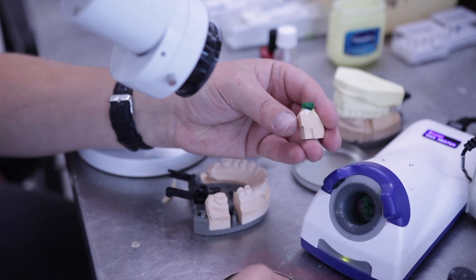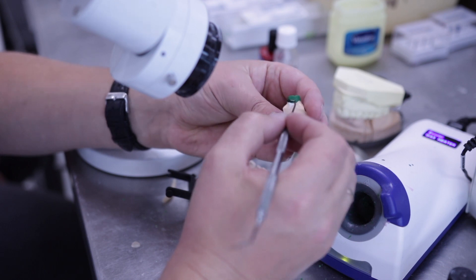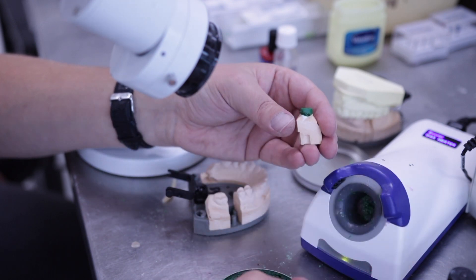If the patient has a sub-gingival preparation, you can design your framework with a lingual collar or band, without sacrificing aesthetics.